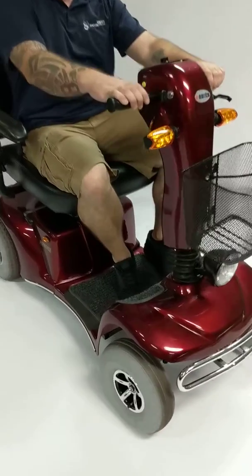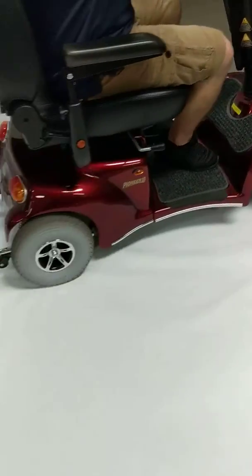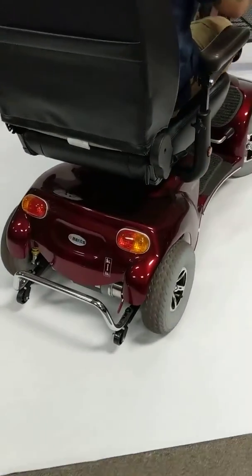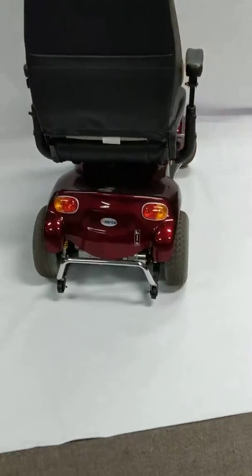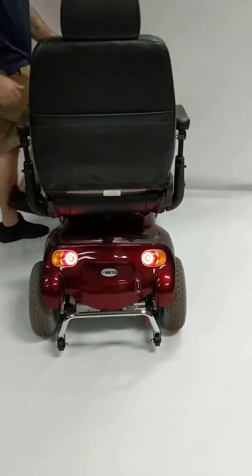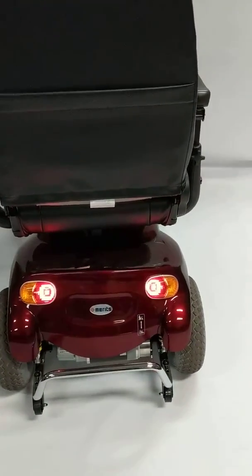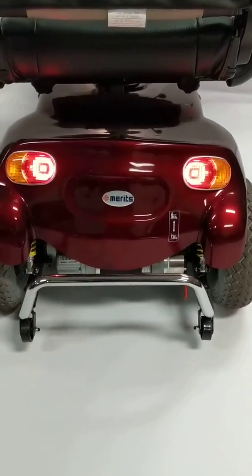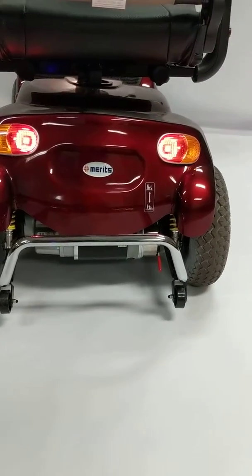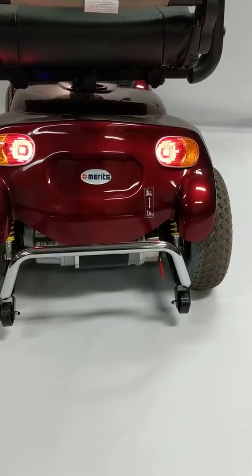On the back side of the scooter, I'm going to show you the lighting package. It's a very nice scooter for outdoor use. If you're going to use it indoors, it must be a very spacious building.